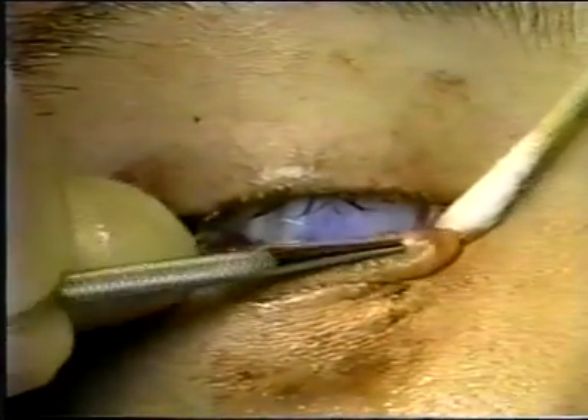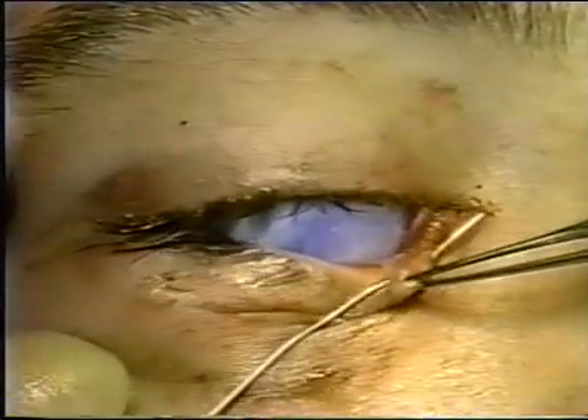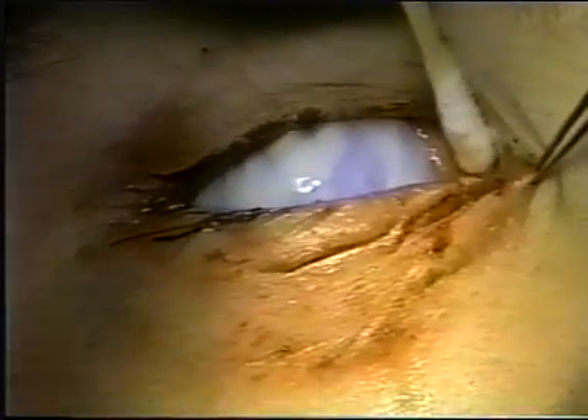We can see that the punctal dilator is visible through the distal cut end of the canaliculus. Using a number one Bowman probe, the canaliculus is clearly shown to be lacerated approximately three to four millimeters from the punctum. Drying the area in the medial part of the canthal angle, it is possible to find the distal cut end of the canaliculus.